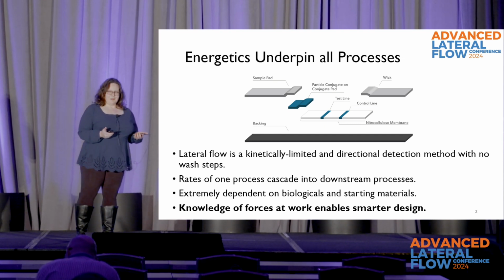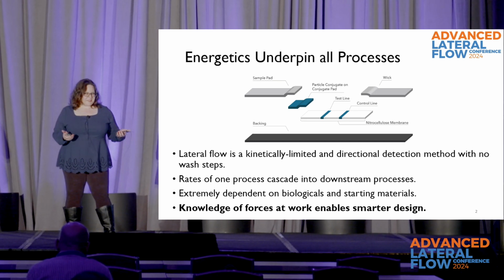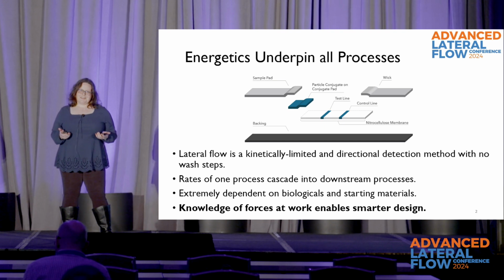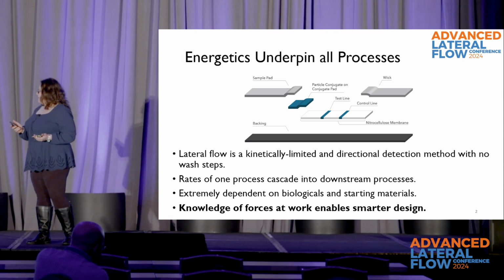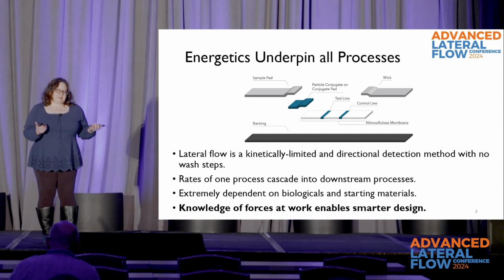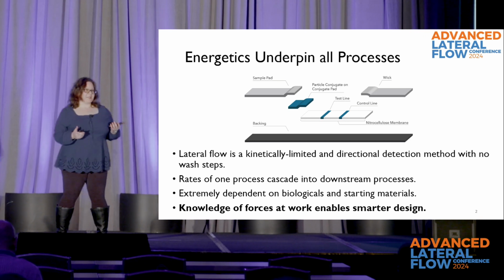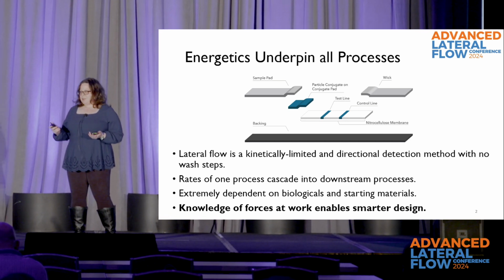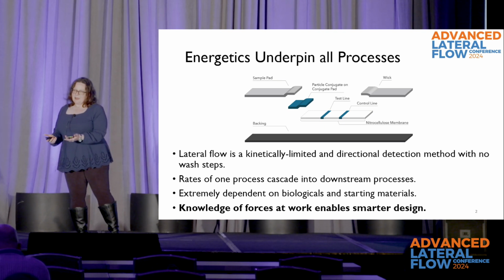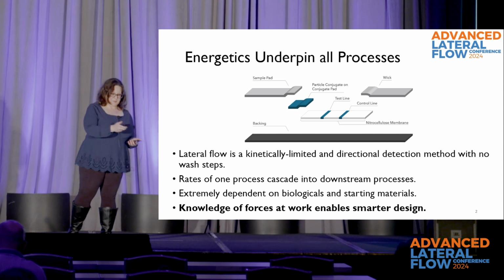So lateral flow, actually, it's kind of amazing that it works because there's so many things against us with lateral flow, and yet it does, because the antibodies in lateral flow are pretty amazing things. Because of that, your lateral flow is really dependent on your biologicals and your processes that you use. And knowledge of these forces will enable you to take a look at your data in the lab and be like, oh, I see that. That means this, therefore I need to do this.